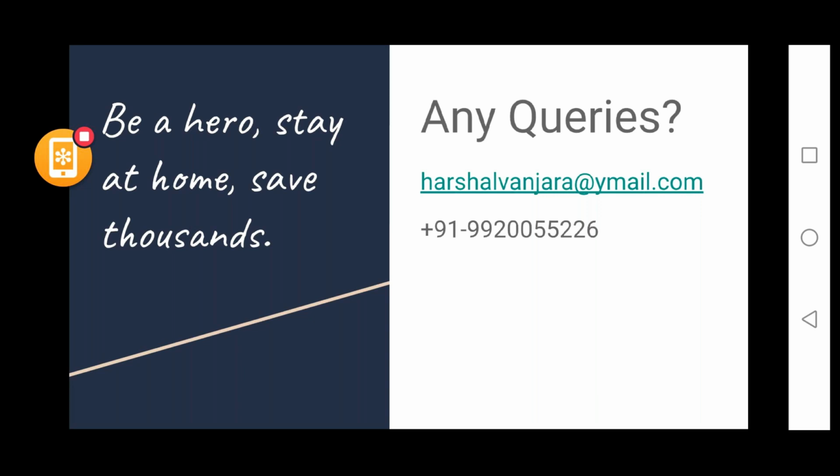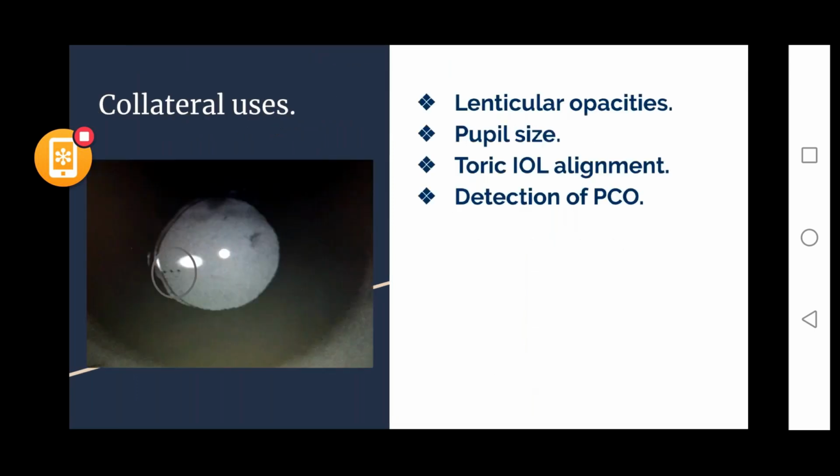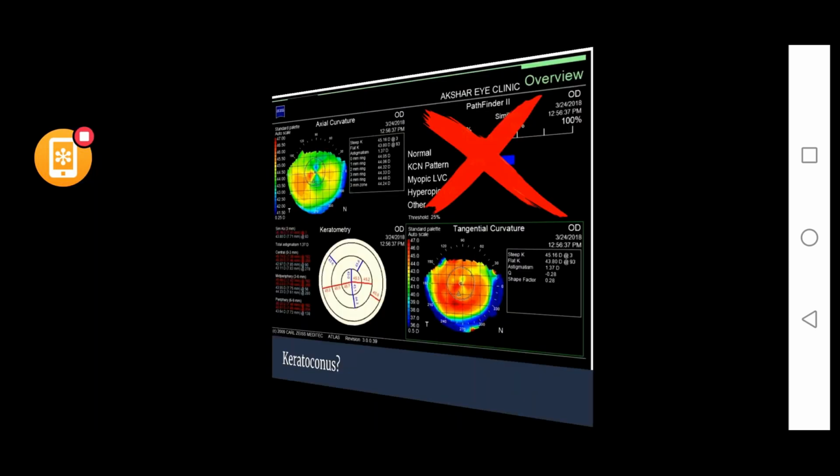Yes, and that was the question. If anybody has a question, please unmute your mic and ask. I think we have a question from Wrinkle. The question is, could you please once again describe the last slide? The collateral uses, is this what you're talking about, Wrinkle? No, the one slide with the equation, where the value shows wrong due to tear instability or something. Yes, that one.